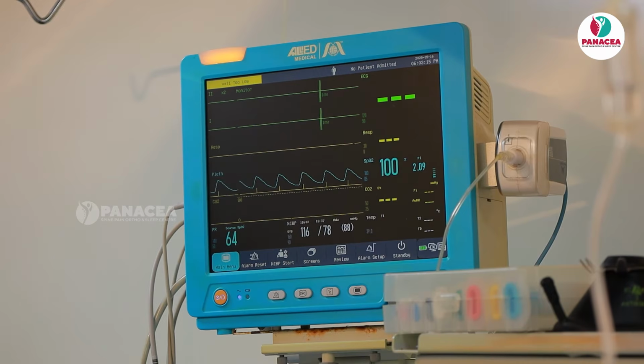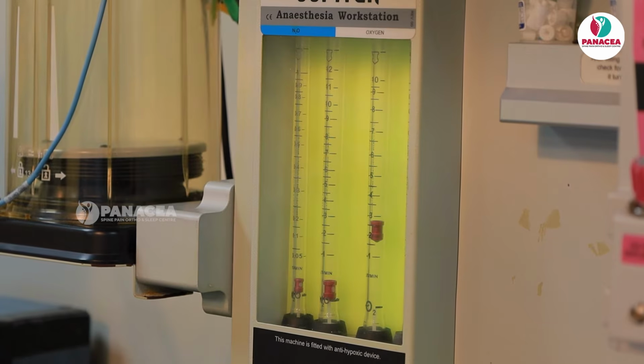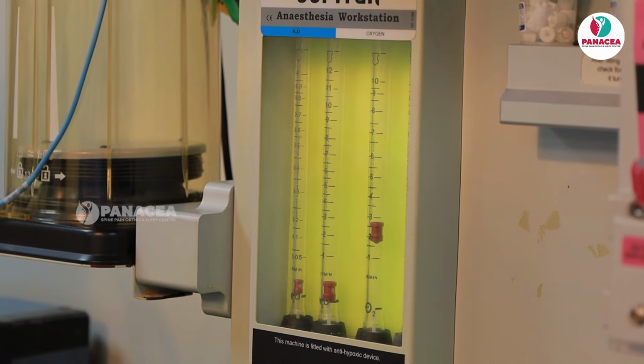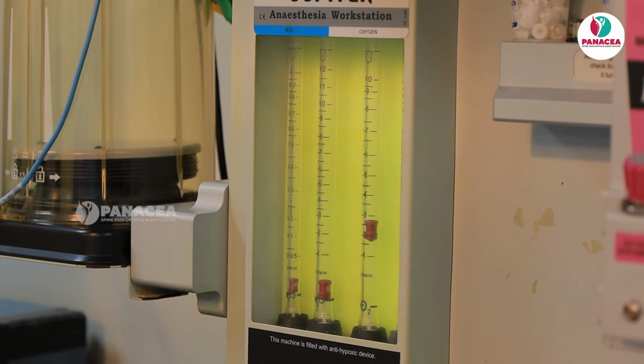Standard ASA monitoring is mandatory. The patient is connected to BP as well as pulse oximeter, because sometimes the patient can go into vasovagal shock because of the local anesthetic. So it is mandatory to have ASA monitoring. The patient is connected to oxygen too. So almost 2 liters of oxygen is given through nasal prongs.